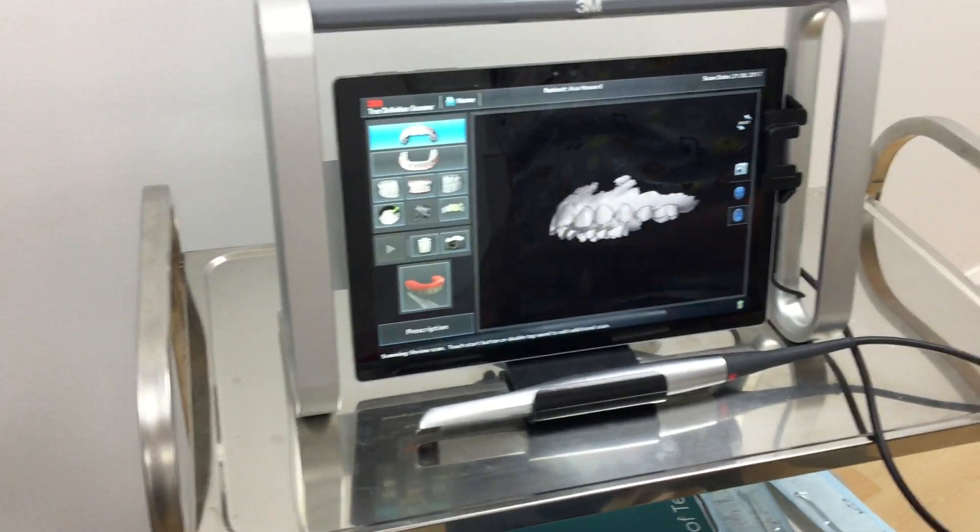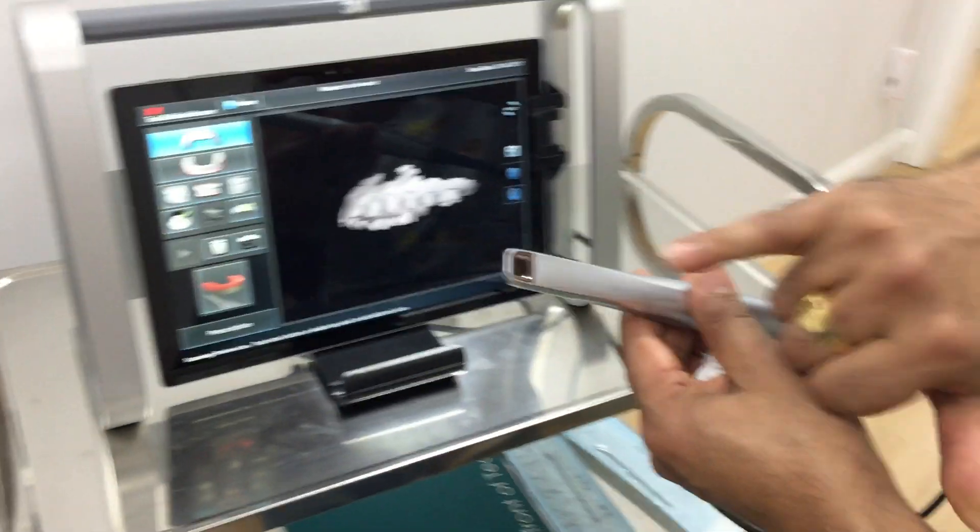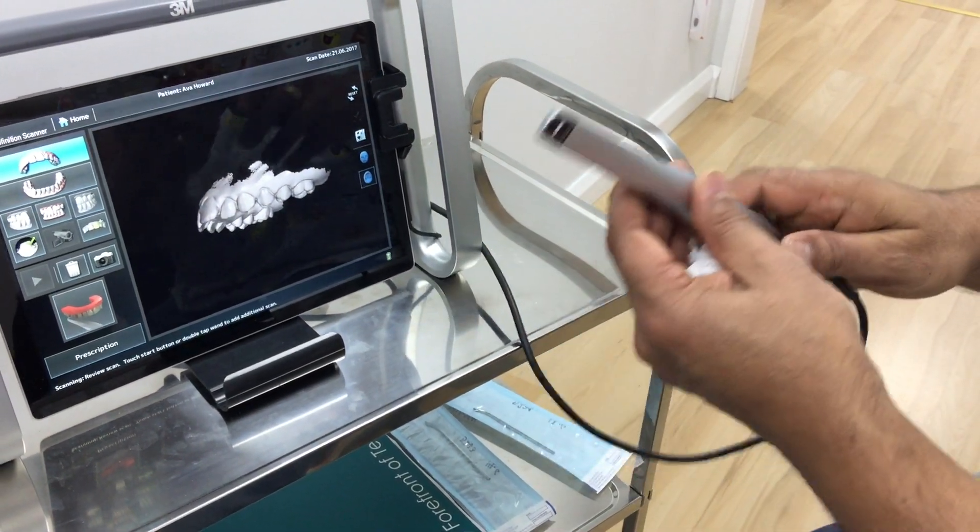This is the screen. I've just completed a scan of a young lady. This is the part that goes into the mouth, and that's the area there that captures the image.